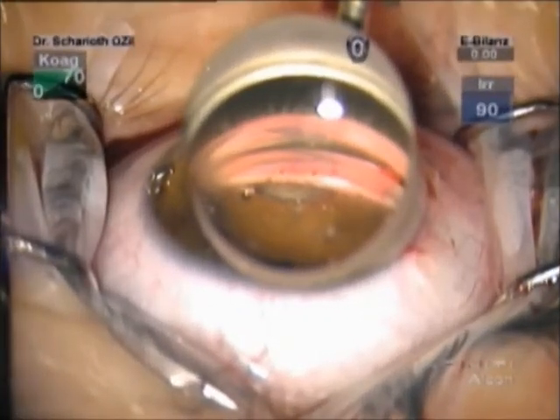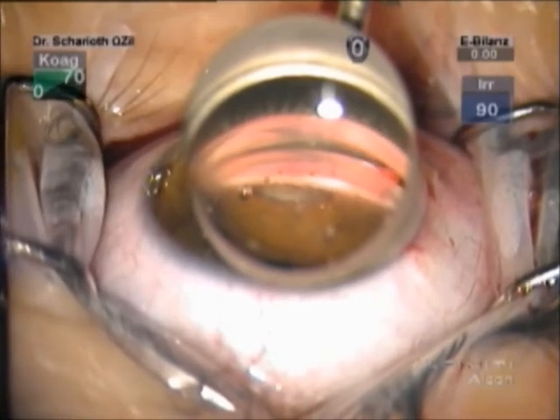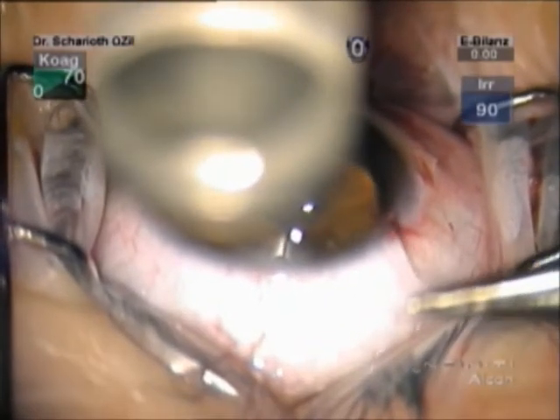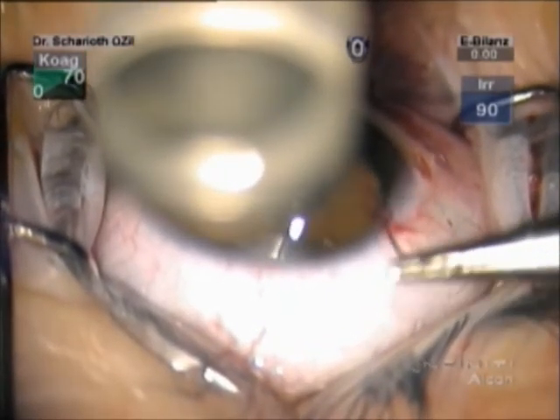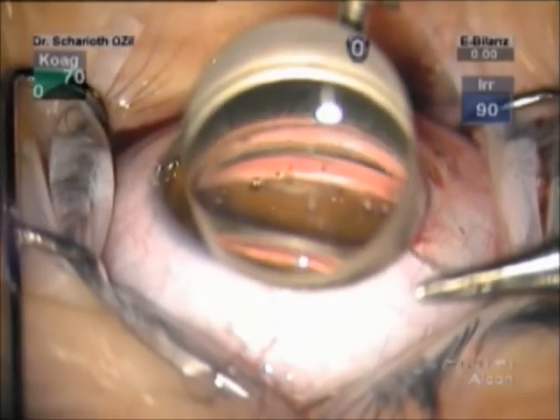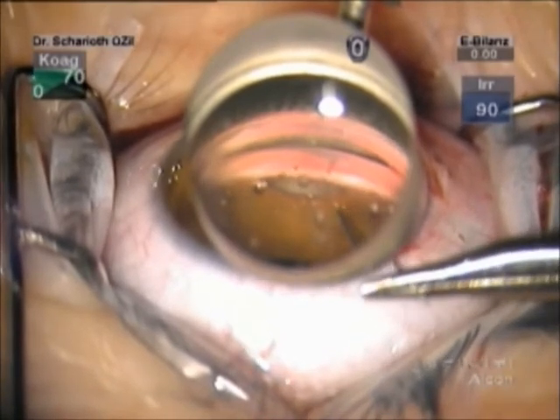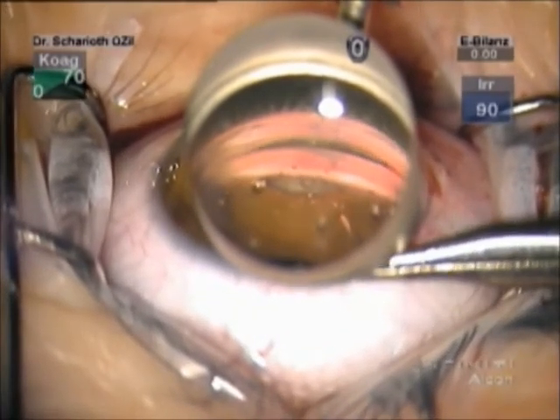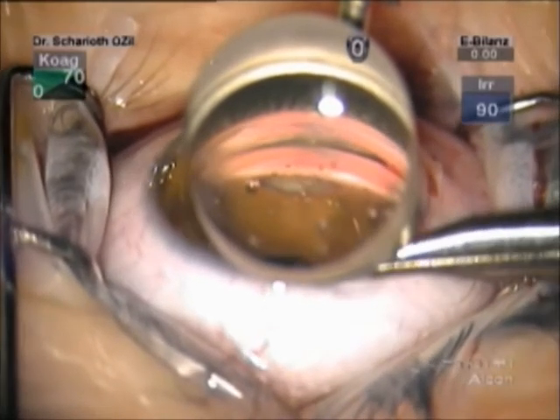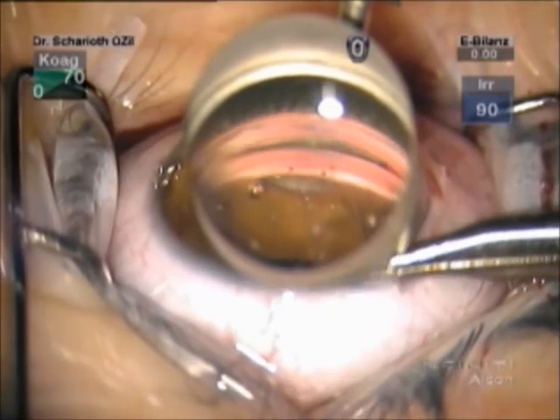This is a case of cyclodialysis cleft syndrome after a complicated trabeculotomy in congenital glaucoma. After one year of unexplained hypotony and several re-interventions, the patient was referred for a secondary opinion. The anterior chamber was filled with viscoelastic device and under direct view of the anterior chamber angle the diagnosis was proven. We decided on cyclodialysis repair with ab interno placement of several 10-O polypropylene sutures.